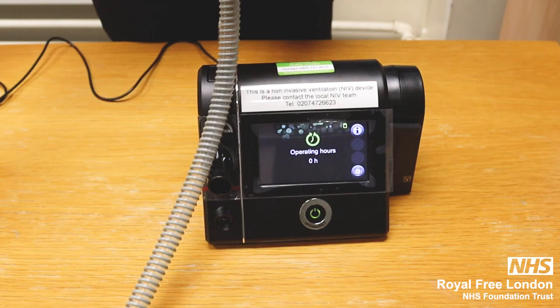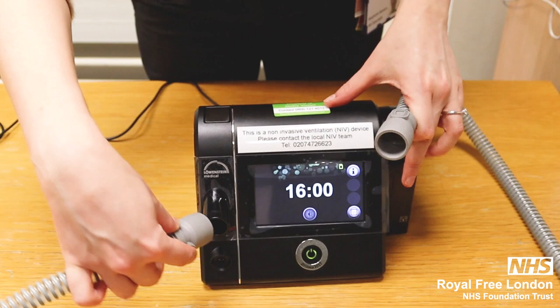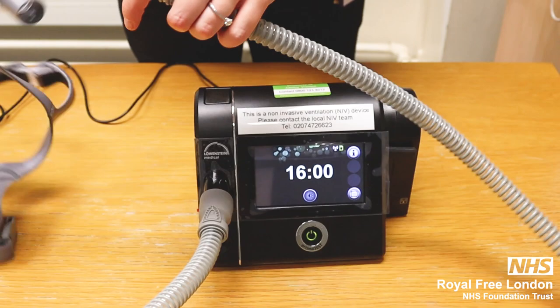Then you take the tubing. The tube has got the same end on both sides, so it doesn't matter which end goes in the device. You connect one end to the machine and the other end to the mask.